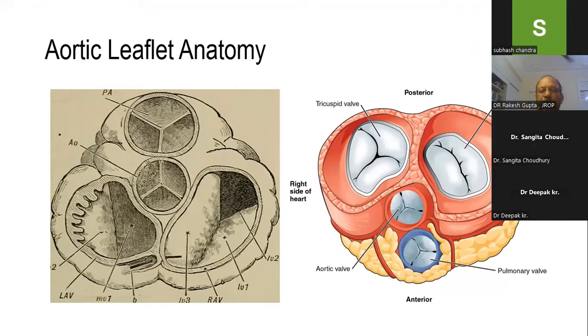Somebody was asking, how do we see a tricuspid valve? Here, in 3 dimensions echo, we can really look at this tricuspid valve. One is septal, anterior and inferior walls. We can very well see that. That's what we do number of times in our lab today. We look at these 3 leaflets separately.